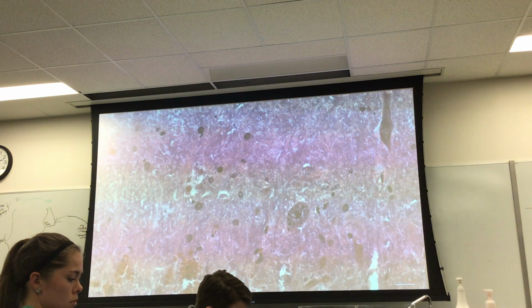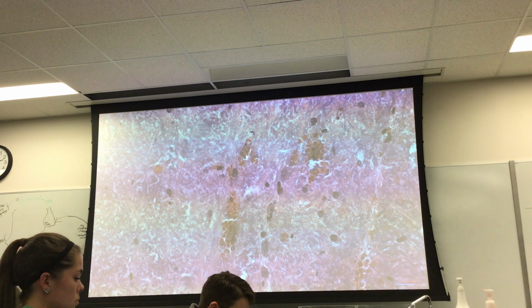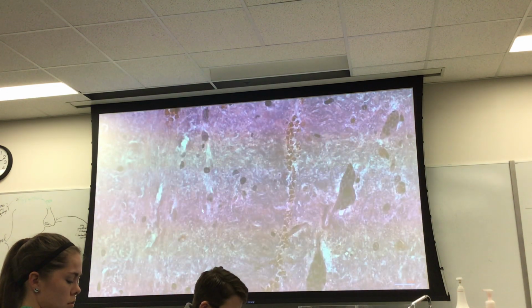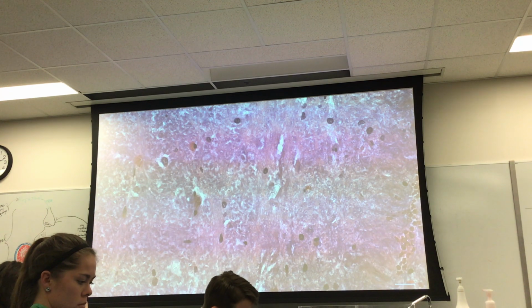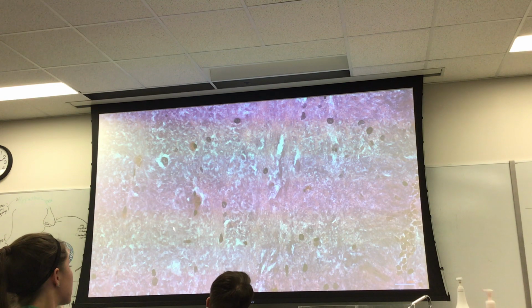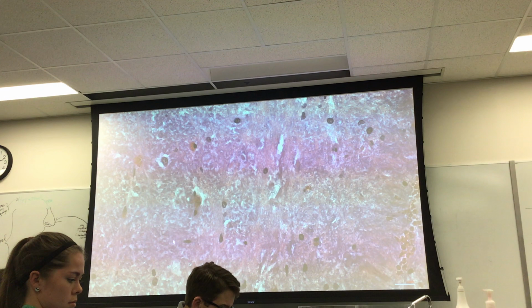Don't necessarily expect to see one. They're kind of hard to find. Just make sure you're not looking at a blood vessel, because if it's a blood vessel like these here, a flat dark cell would be an endothelial cell. But a microglial cell will simply be a flat cell just sitting out there, like maybe that one. Oh, that's probably the one right there, a microglial cell. Flat and dark. All right, and if it lines the central canal, it's called an ependymal cell.